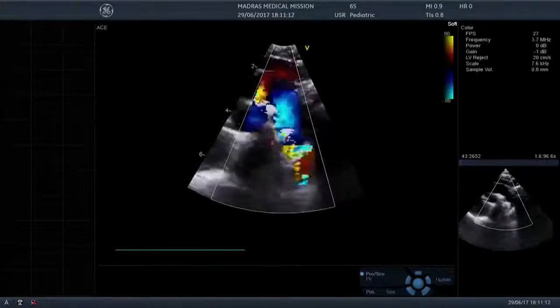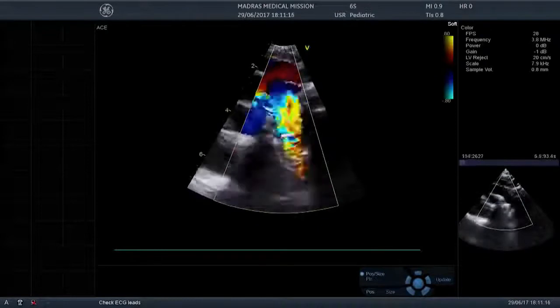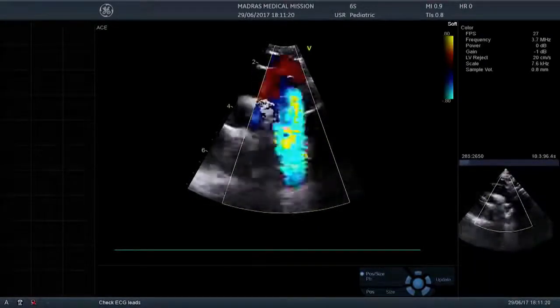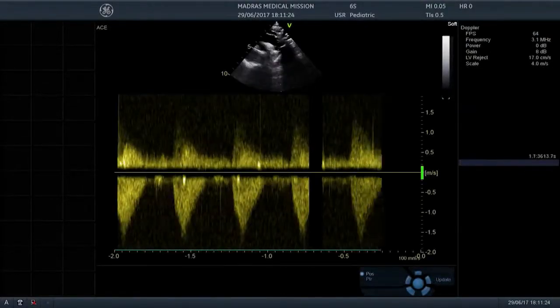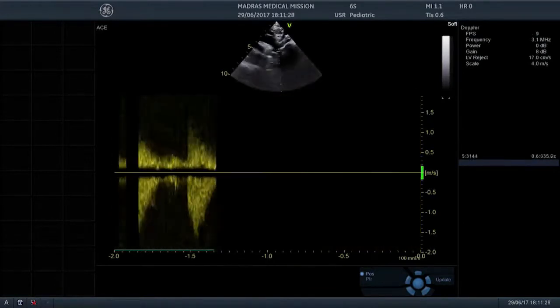Okay, so Omar, what do you think of that? So you see, there is probably some protrusion, and then of course the color will confirm it or not. I think there is a clear protrusion in the aorta on the Doppler, which happens often. Freeze it. It looks okay.